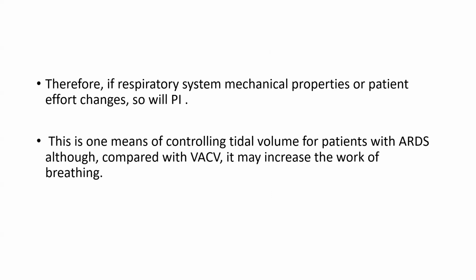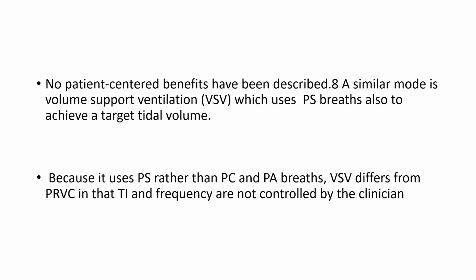Therefore, if respiratory system mechanical properties or the patient effort change, the ventilator will change the inspiratory pressure. This is one of the means of controlling tidal volume for patients with ARDS. Although, compared with volume assist control ventilation, it may increase the work of breathing. No patient-centered benefit has been described.